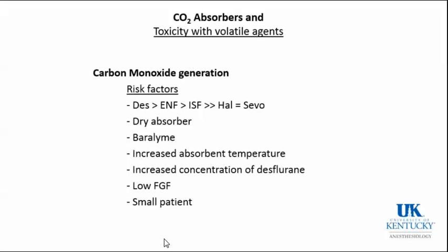That was because if the oxygen was left on over the weekend, it would flow through the CO2 absorber and make it very dry, and when they turned on Desflurane, you could get a significant amount of carbon monoxide.